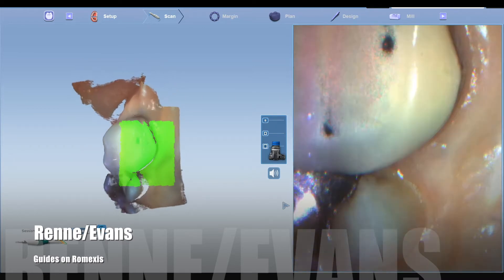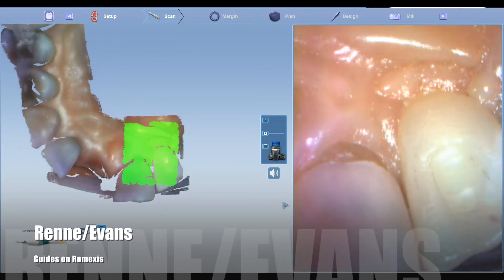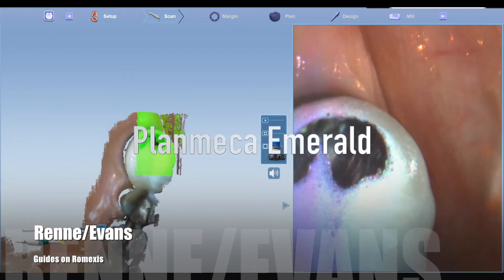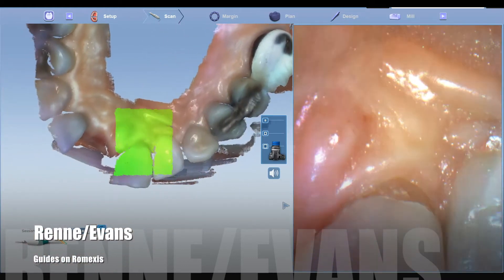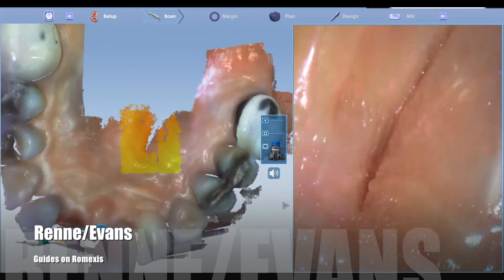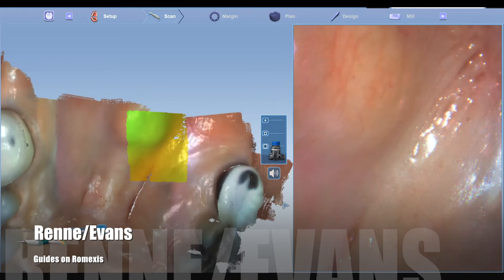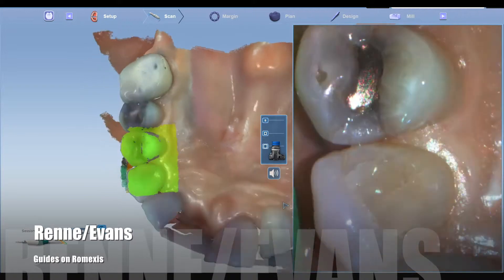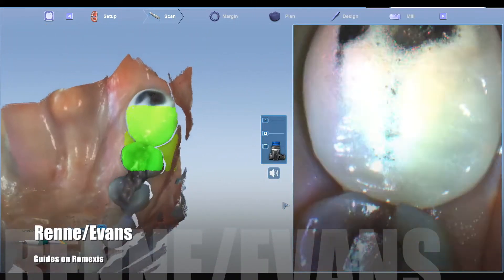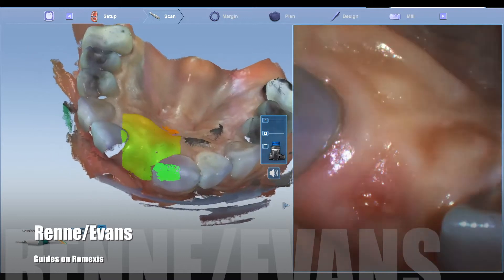One thing that's nice is the Emerald scanner with the full arch scanning is pretty simple once you get the workflow down and learn how to do full arch scanning — it's pretty routine. Anybody could do it. Full arches take around a minute to two minutes depending on the case, who's scanning, and how much experience they have.